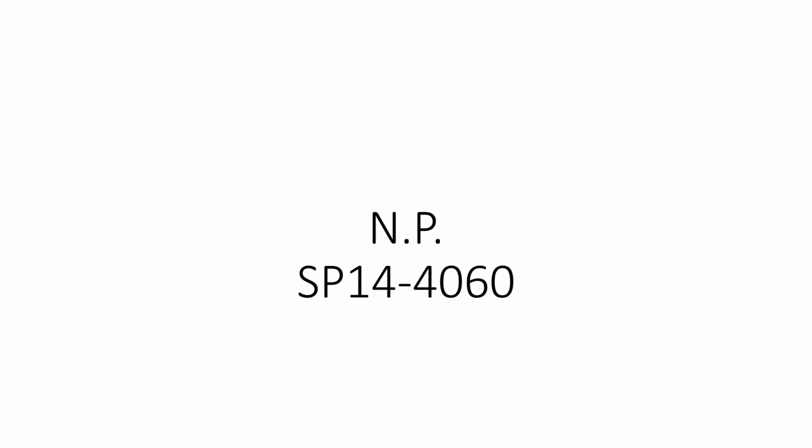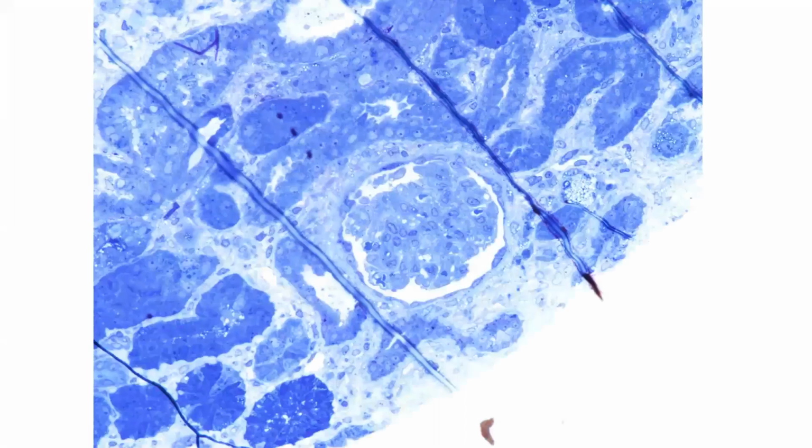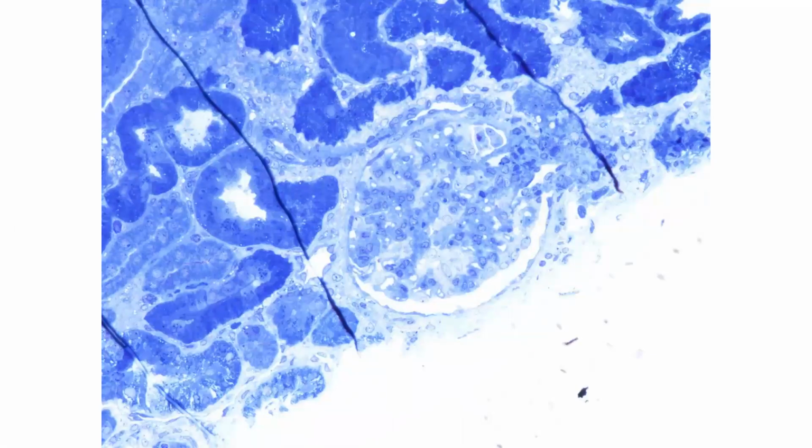As Daryl mentioned, his 2014 biopsy was inadequate in the sense that we received only medulla for light microscopy. However, Flynn was able to salvage some of the tissue that was used for immunofluorescence and process it for electron microscopy. I'm going to show you a couple of toluidine blue images of these glomeruli, which were interpreted as looking pretty normal. You could make a case for maybe a little bit of mesangial hypercellularity here, but that could just be toluidine blue weirdness.